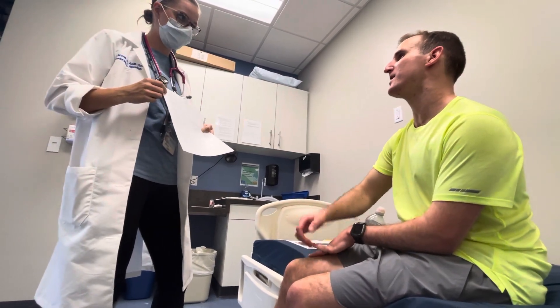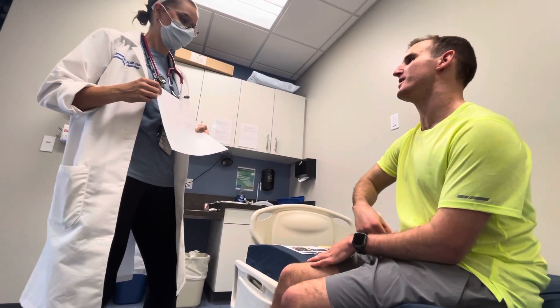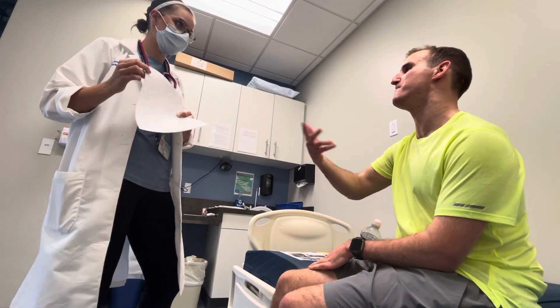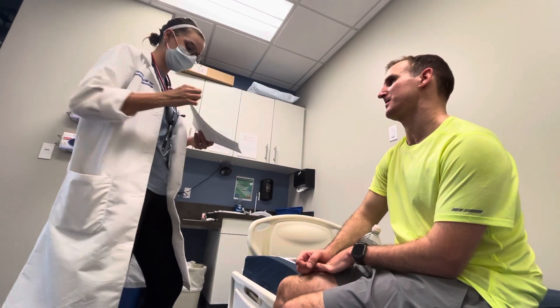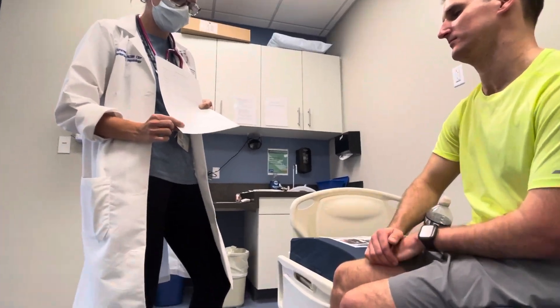It doesn't matter if you go to bed at two in the morning or stay up all night — you just write whatever time you take it off, even if you only get a couple hours of sleep. And if the next day you get up at 11 or whatever, then you won't put it on till later — that's fine. You just put it on whenever you wake up and take it off whenever you go to bed. You're going to fill this paper out for seven days in a row.